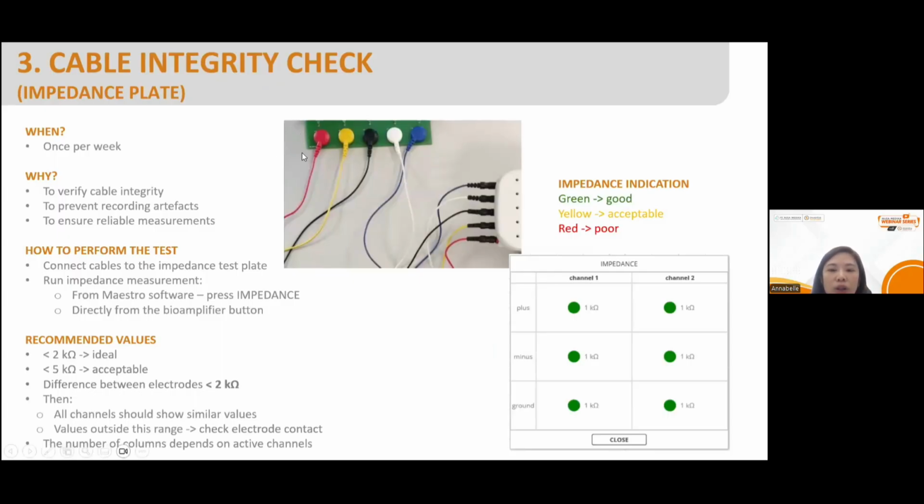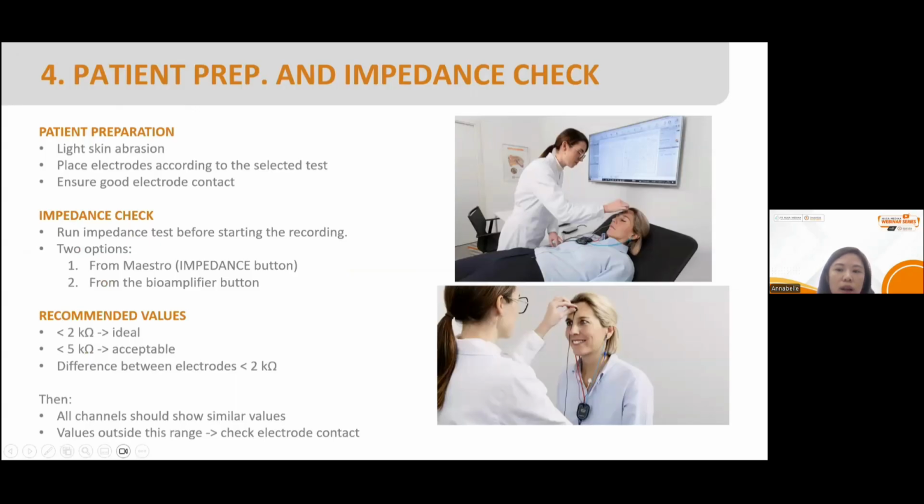In the past, remember this impedance page? We check the impedance calibration, and after checking the calibration, you check the impedance with your real patient. Okay, this is the recommended values of the impedance, and this is the demo pictures.